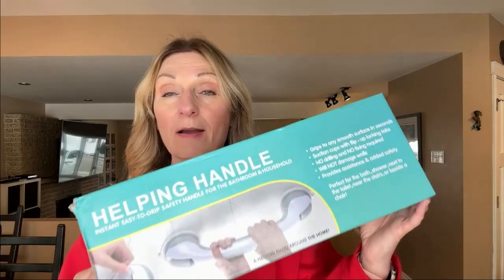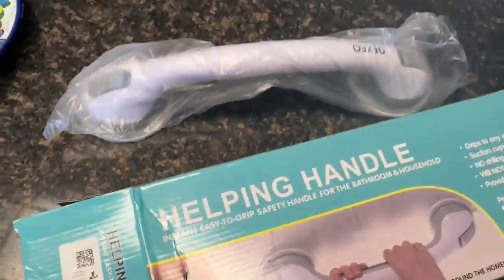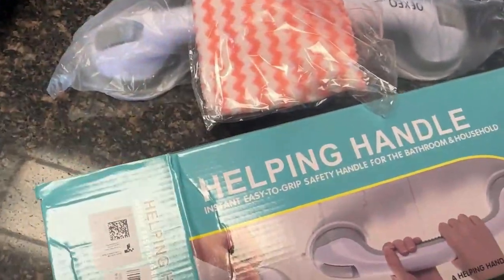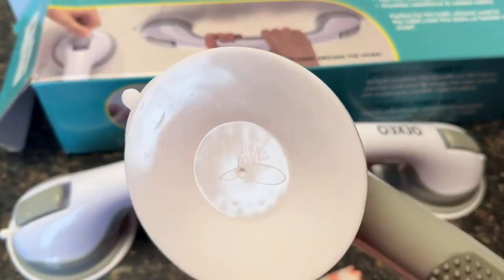I was sent this by a brand for an honest review. Let's unbox it and take a look at it together. As we begin to unbox it, we see that it actually comes with two of these helping handles inside, and a cleaning cloth.